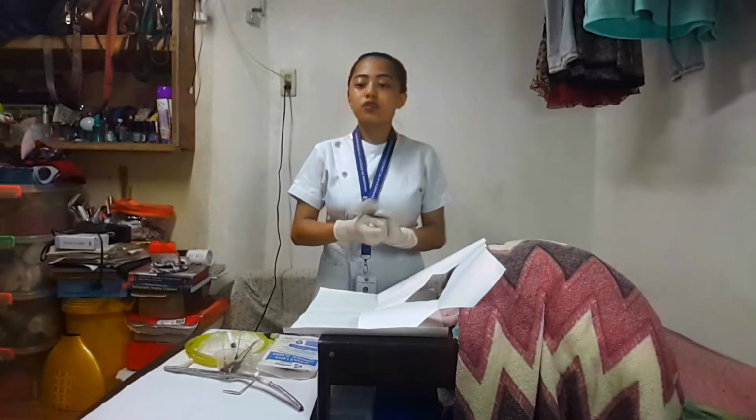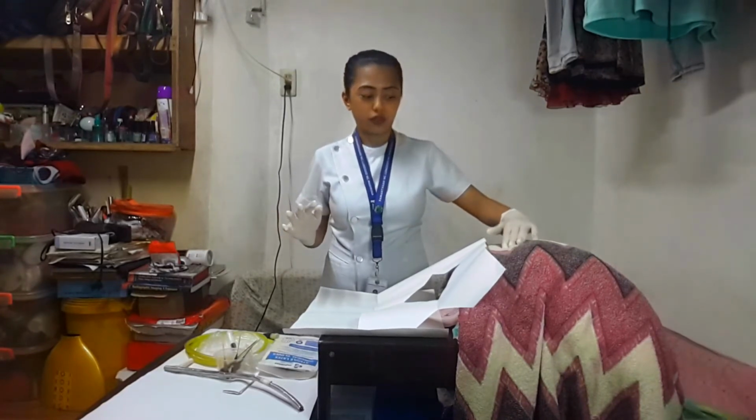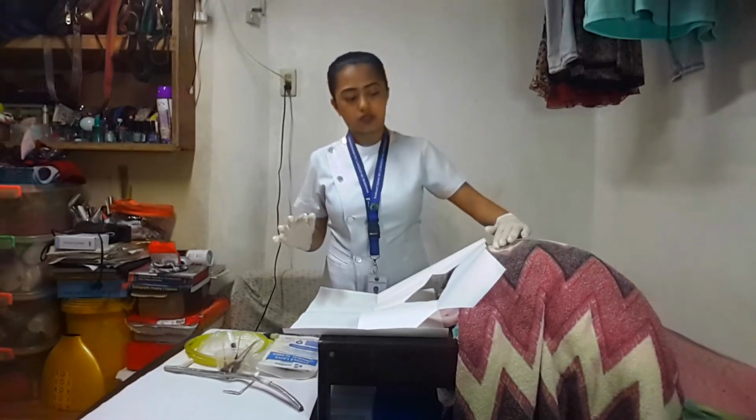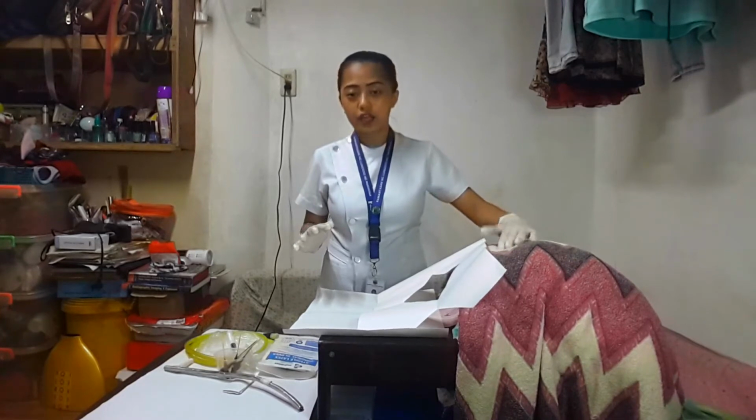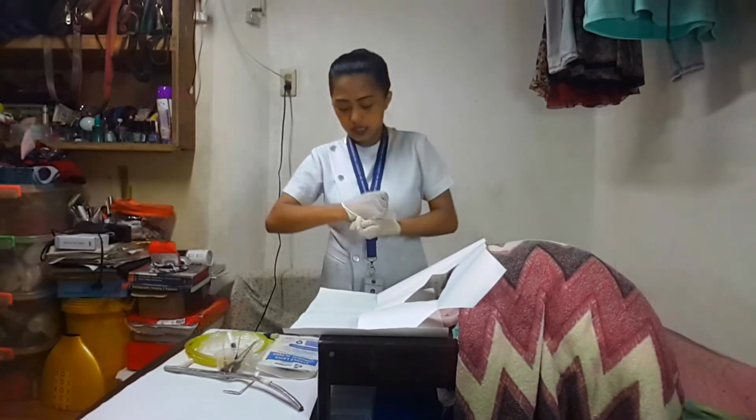Alright, so after that, we need to assess the fullness of the patient's bladder. In doing that, we need to palpate the bladder over the symphysis pubis. Alright. So after that, we need to remove our clean gloves.